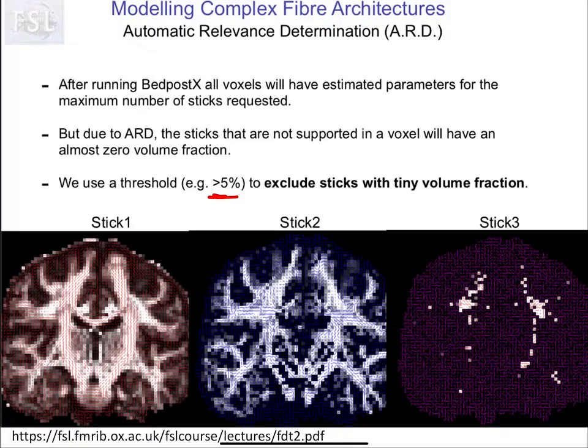This shows that in a lot of voxels in white matter, there's evidence for at least 1 stick. There is also evidence for 2 sticks, quite a lot, and that matches what we saw before about which voxels had at least 2 fibers. But as you can see, relatively few voxels have enough evidence to support 3 sticks.